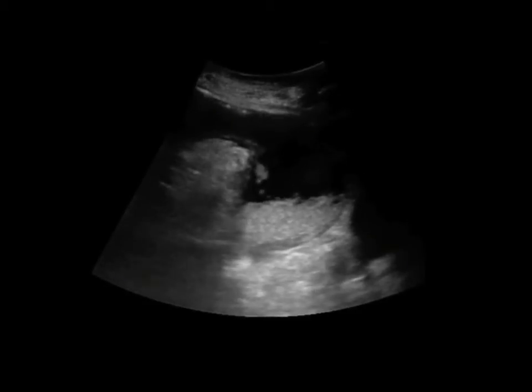This is perhaps my favorite ultrasound video clip of all time. I call this the waterfall of poop. Again, very dilated, fluid-filled structures with some fecal material as well, and here we're not really even seeing any peristalsis at all.